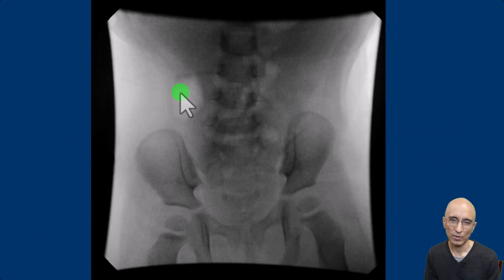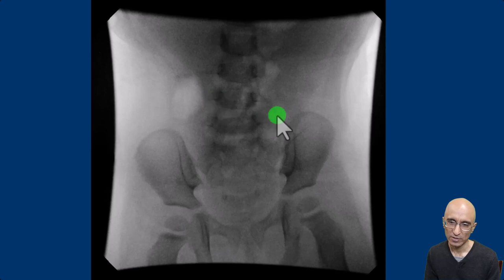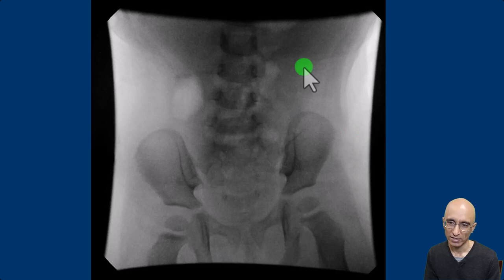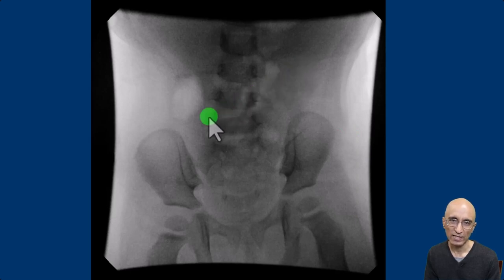So we took this child for pneumatic reduction. On the initial image, which is typically done to exclude pneumoperitoneum — which is a contraindication for pneumatic reduction — there was no free gas identified.